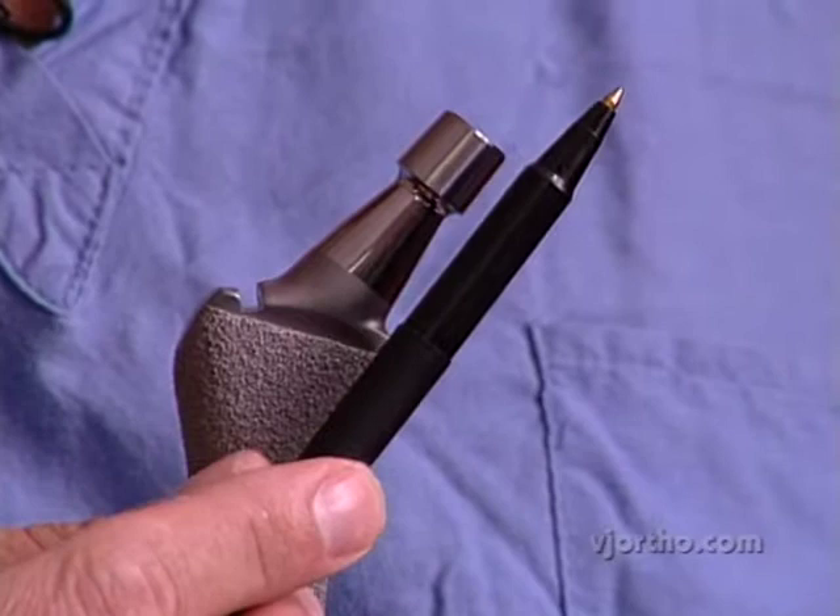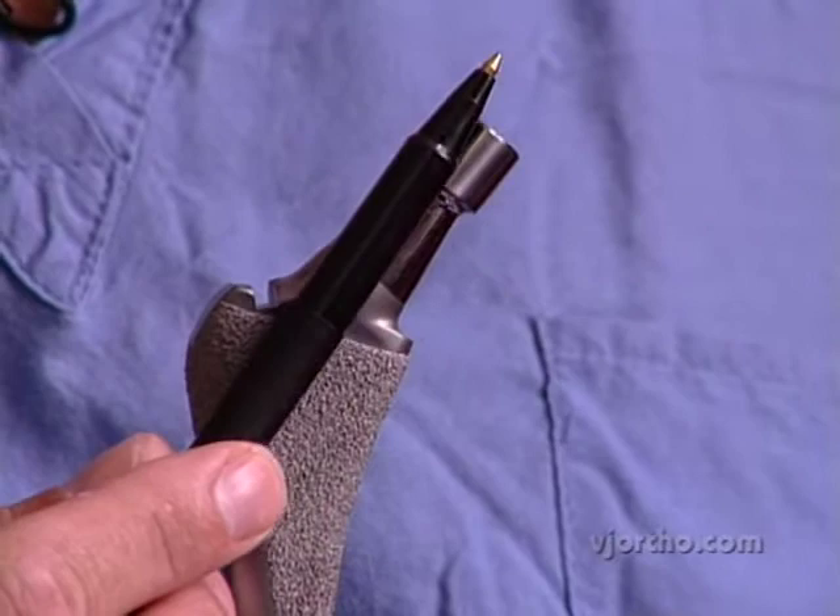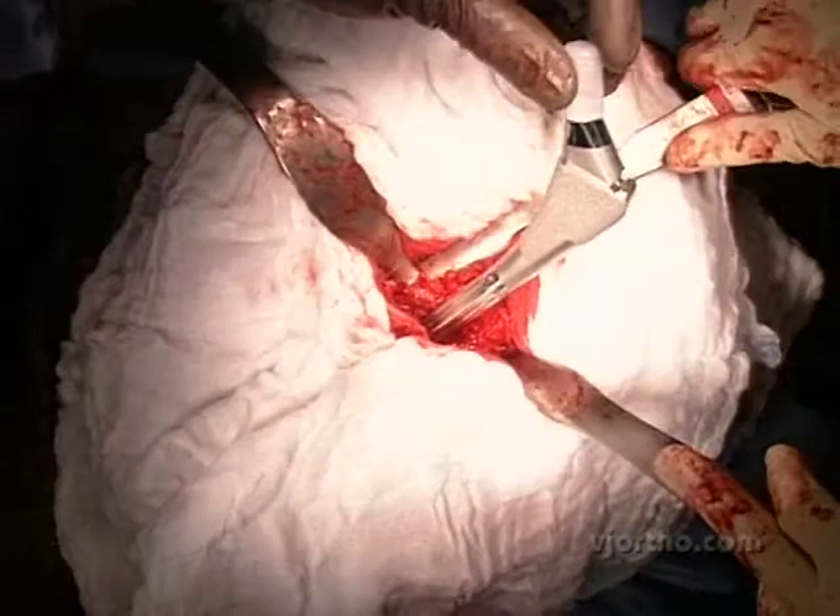If you just go plus six or plus eight lateral, you know you're not changing leg length, you're only improving offset, and designing an implant that just goes straight sideways I think is a better way to go.